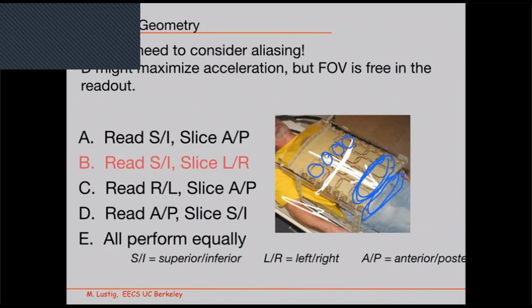Does that make sense? So it's not trivial. You think about a technician now, who needs to think about that. You need to know a little bit, do some accounting, do some signal processing, underdetermined systems. But the hands are a problem. That's why you want to do slice selection in this direction.